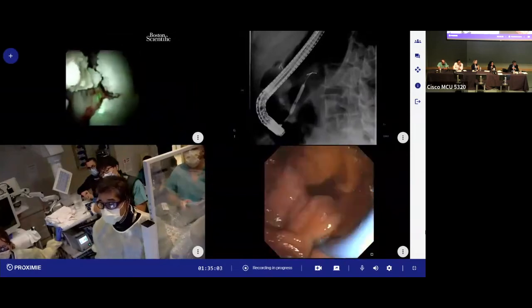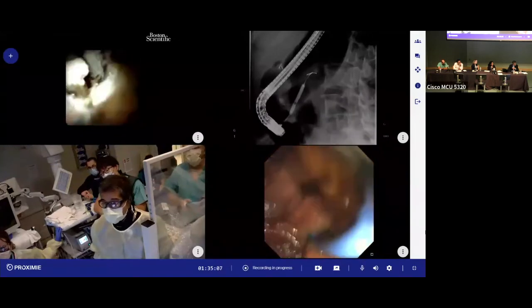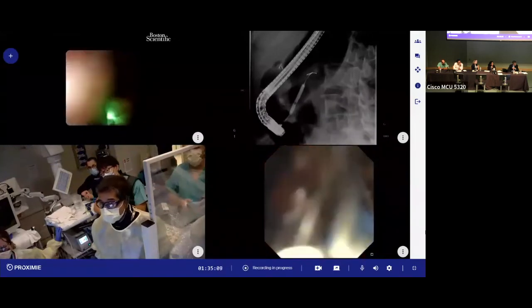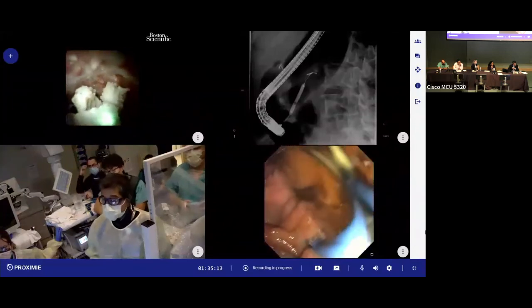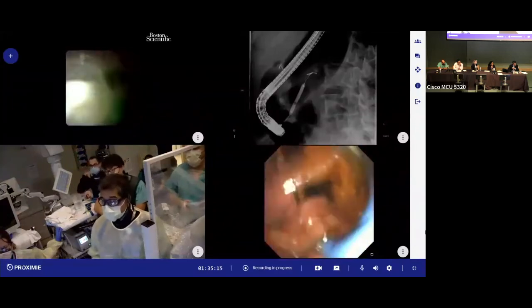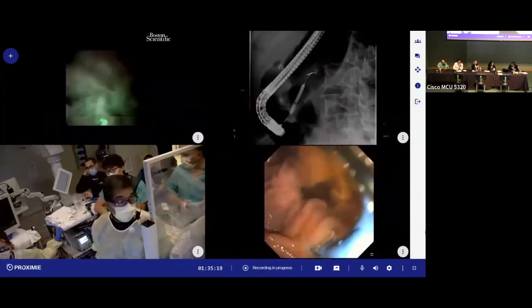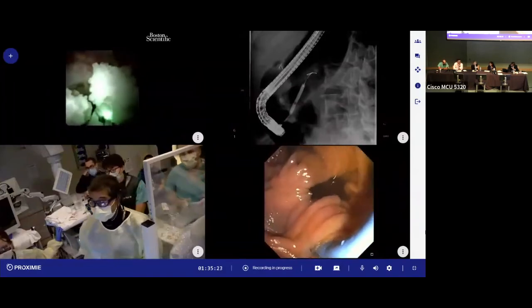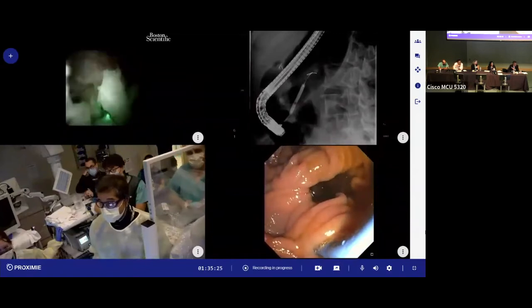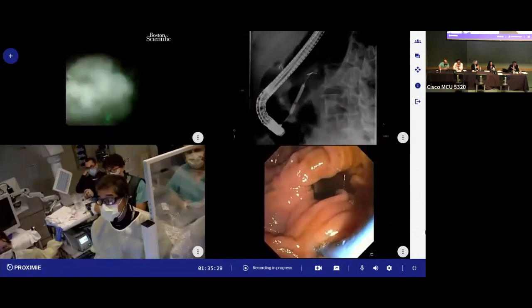And any guesses from the panel as to how many seconds you could have it on a bile duct and not cause perforation? Any guesses? 10. All right, maybe that wasn't a very interesting question, but it's about 5 seconds, up to 5 seconds.